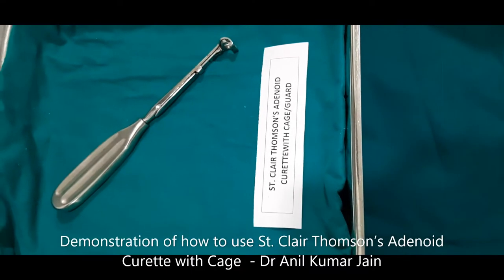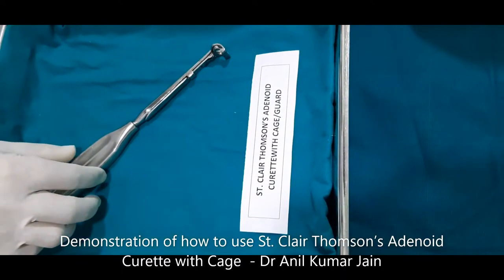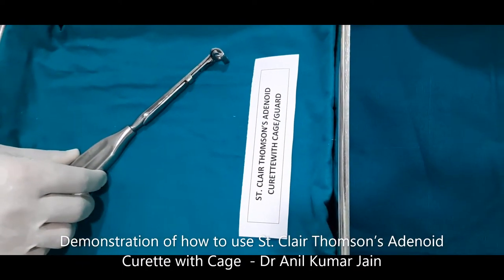Hello friends, greetings from Dr. Nikomarjan. Now this instrument is St. Clair Thomson's Adenoid Curette with Cage or Guard.